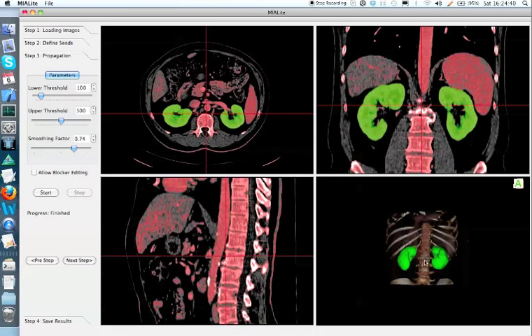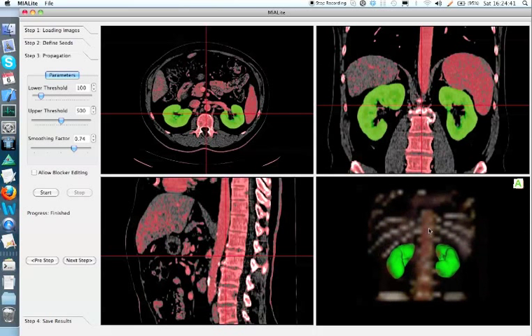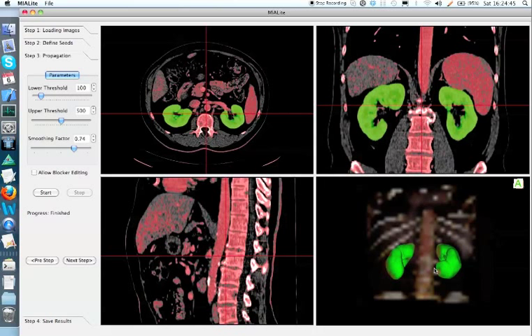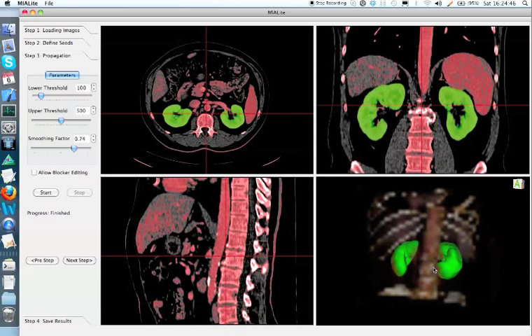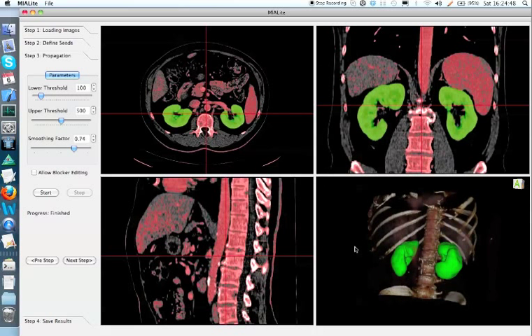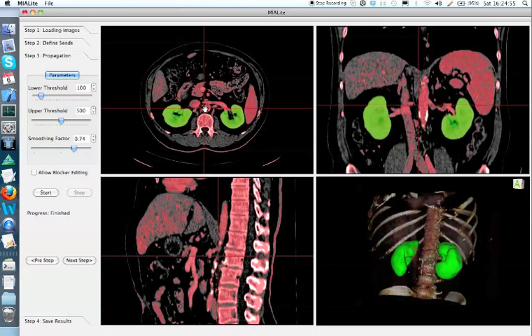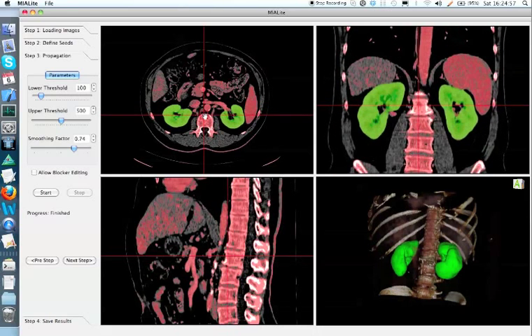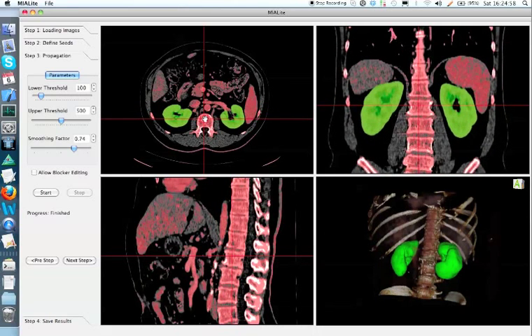Here we get our segmented kidney, but using a higher smoothing factor might have some side effects that will decrease the segmentation accuracy, like cutting off some small structures.